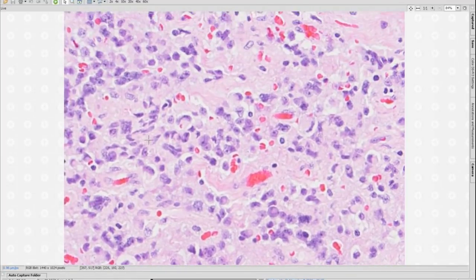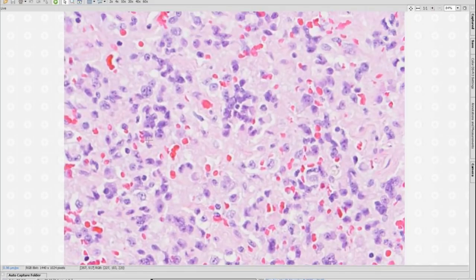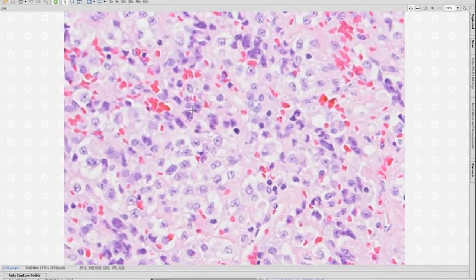You can see the cells here get smaller, and they are more compatible with some sort of adenoma subtype, at least we have to look into that possibility. Something that was a subtle clue was that some of these cells had a little bit of an eosinophilic eccentric inclusion. The adenoma subtype here is not immediately apparent, right? Some cells are lightly eosinophilic, other ones are a little more amphophilic. But you do have a few of these inclusions.